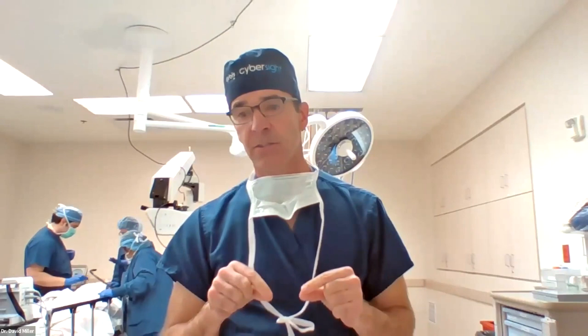Have you tried explanting the IOL via a well-constructed scleral tunnel? Yes, I have done that prior. And the problem with the scleral tunnels is oftentimes these surgeries are old enough that the sclera was already incised and sutured together 20 years ago, and it's very, very thin. So they make a second scleral tunnel in the same location. It's difficult. You end up either being too shallow or too deep. If you enter too deep, you enter the anterior chamber too deep, and the iris is prolapsing. If you're too shallow, you have buttonholes in the scleral roof. So I prefer at this point just to go up into the cornea. If it's small, I think we do fine, and even at 6 millimeters, we can suture that well enough to eliminate big refractive shifts.